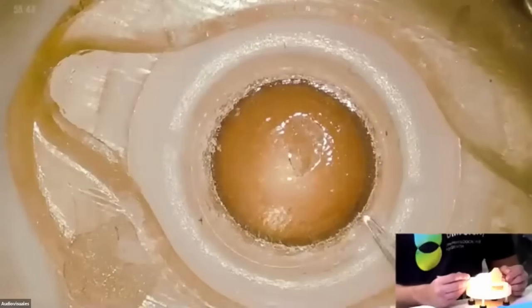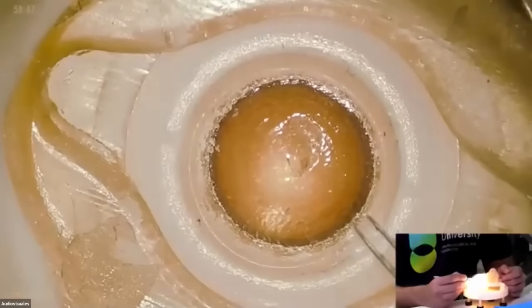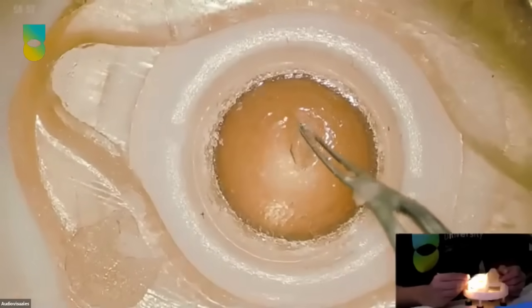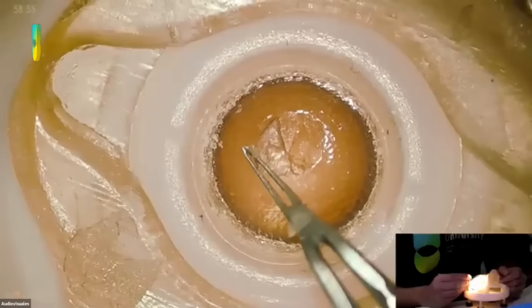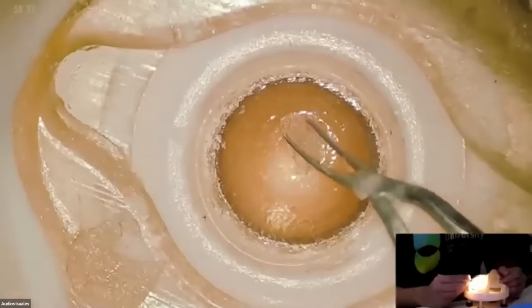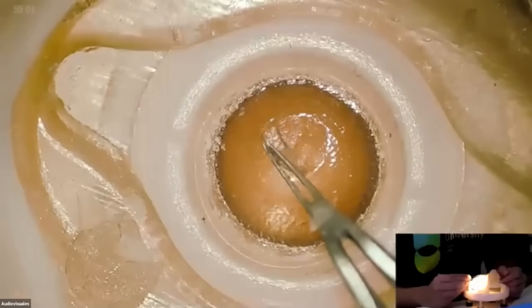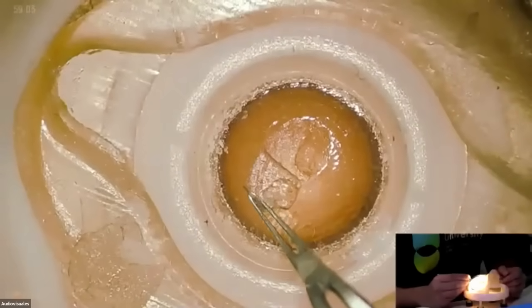And I suggest the Utrata, because you don't have to do the cystotome. With the Utrata, you do the first tear and then you take it and you go on. That's nice.